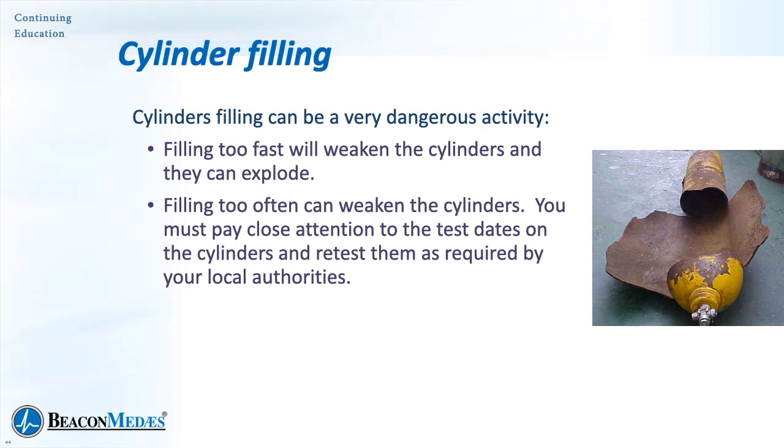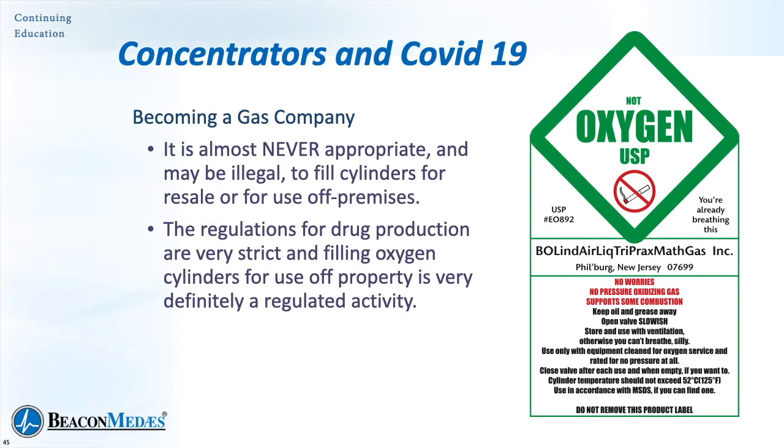So filling cylinders on site can be done. It can be done safely, but it needs to be done with appropriate safeties in place. Now, could you go ahead and take those cylinders and sell them and become a gas company? Well, certainly not in the United States.